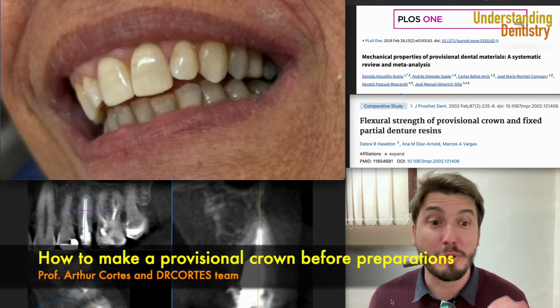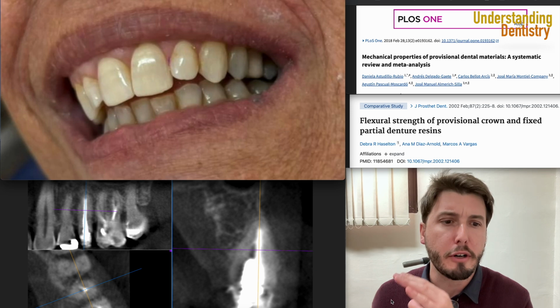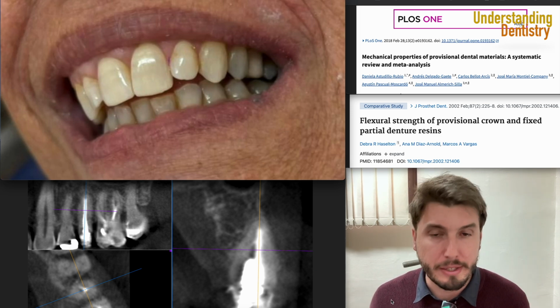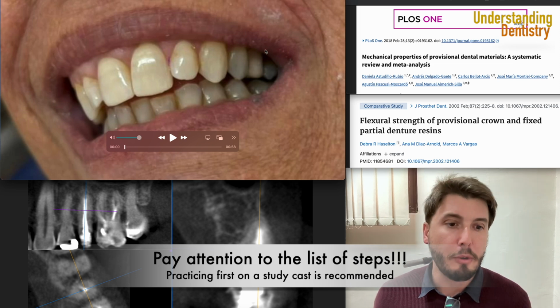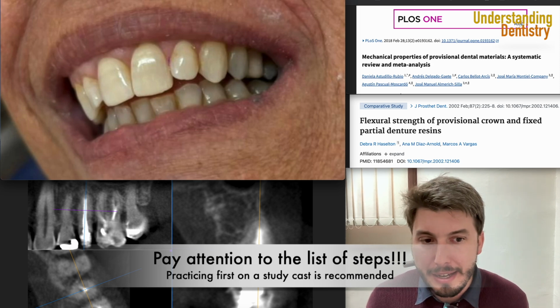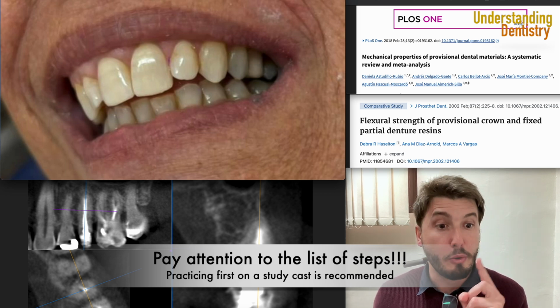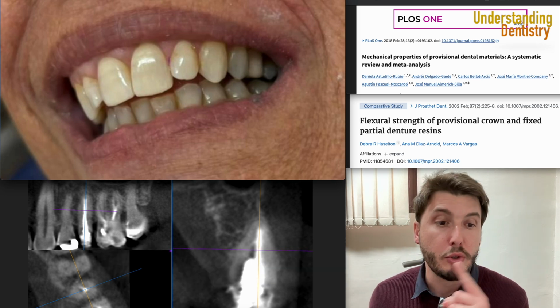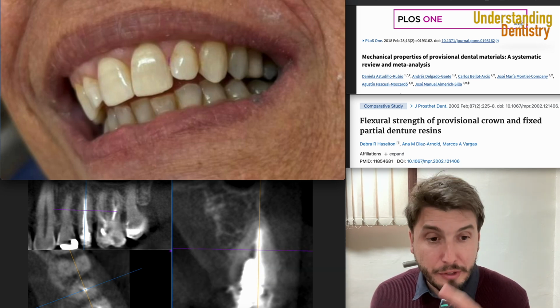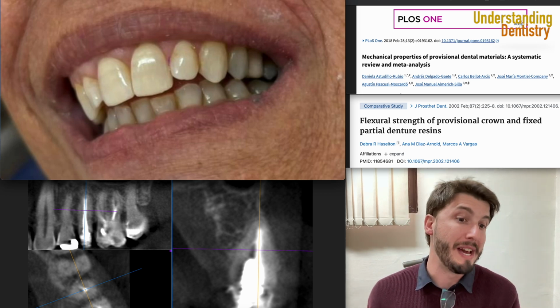Hello guys, and welcome to this video to learn how to do a provisional or temporary crown for basically every case that you want. We have this tooth here, the 2.5, the premolar, and take a look at this. If you have a satisfactory shape of the crown, and you are going to do a prep, probably because of caries or anything else, you are going to do a preparation, and then after this preparation, you want to have a temporary crown for the patient to go back home.